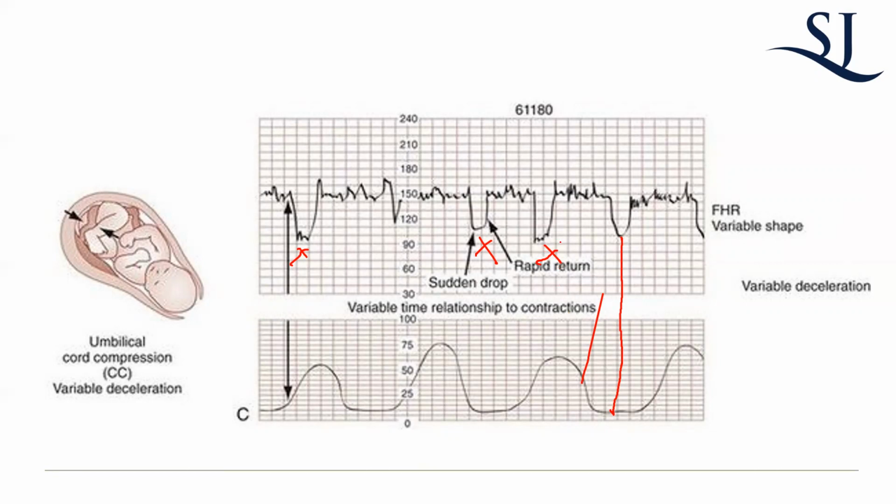Okay, you see that a lot after you perform an amniotomy, which is the artificial rupture of membranes, because now there's not enough space. The treatment that works best is something called an amnio infusion, where you put a catheter in and put a little fluid back in a continuous way, and that gets rid of this. That's also good because you're also placing an intrauterine pressure catheter, and that'll give you numbers to measure the strength of the uterine contractions, which also helps.